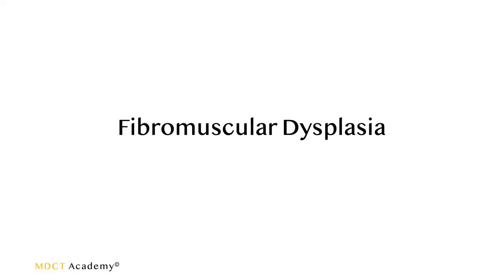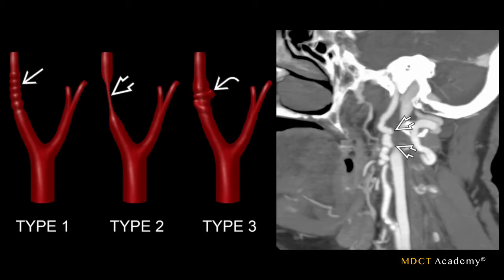Now we'll talk about fibromuscular dysplasia, which was also mentioned in the sensitivity and specificity section of this CTA lecture series. In type 1, the muscular component of the wall — the tunica media — loses its elastin and starts to compress on top of itself, producing bulbular compressions or a bead-like appearance. Type 2 looks almost like a stenosis. Type 3 is a complete combination of both with collapse. On this sagittal curved MPR of the internal carotid artery, you can see the multiple bulbs collapsing on each other — this is a typical type 1 fibromuscular dysplasia.